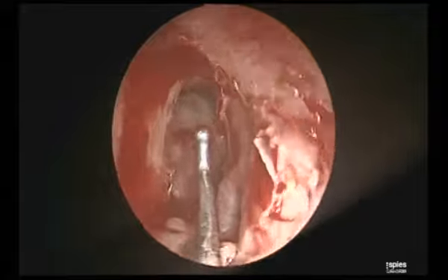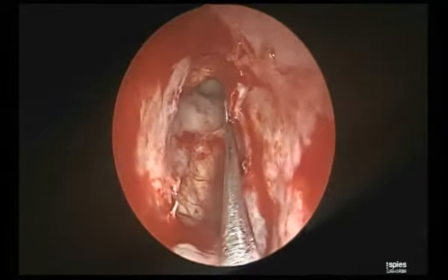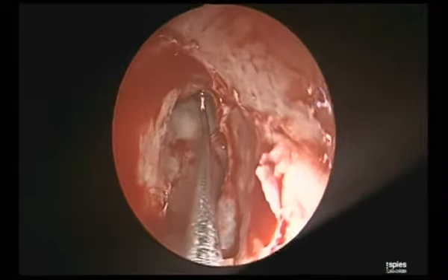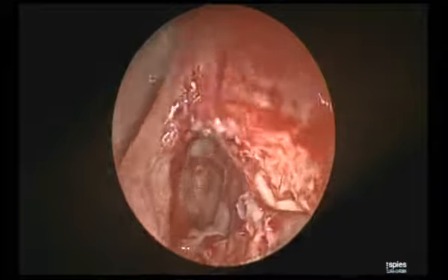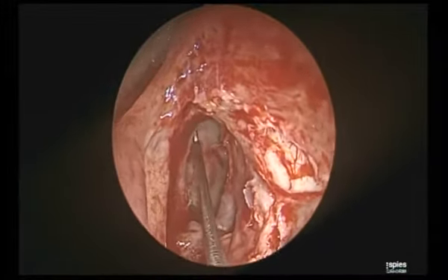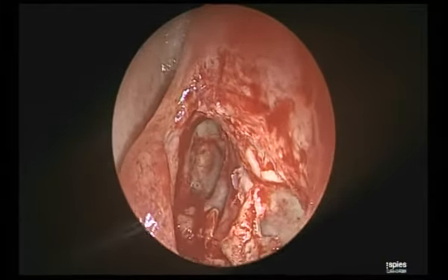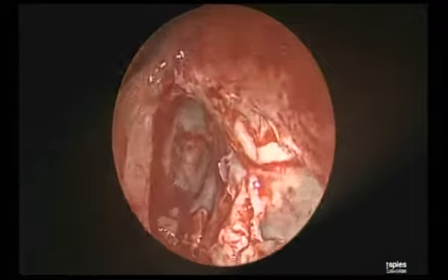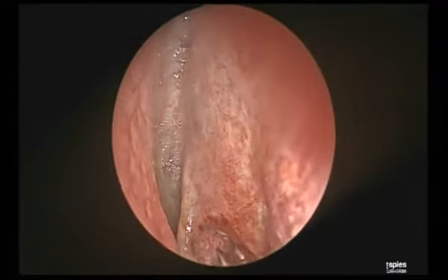So what you have to do is, now with the 70, my lateral limit, can you see? Yes, very nicely, the lamina all the way. My anterior limit, you can see the beak. My medial limit, you can see the middle turbinate. And my posterior limit, you can see the posterior table under the skull base. Can you see? Can I go beyond anywhere? If I try to go beyond anywhere, I'll have to face a tough time with complications.